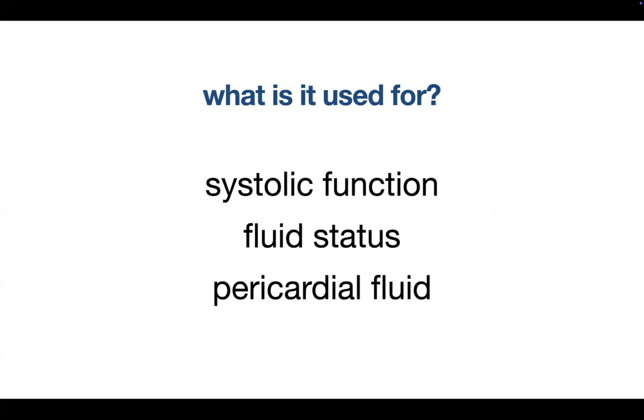We can look at sizes of the ventricle. There's a very clear example the other day, the child in room 8, a couple of weeks ago, we did this. The RV looked, what I thought was, a bit large and abnormal. We got a cardiology opinion. They agreed she had about two-thirds systemic RV pressure. She was started on nitric and improved dramatically. So that again is sort of the algorithm of where echo becomes super useful.